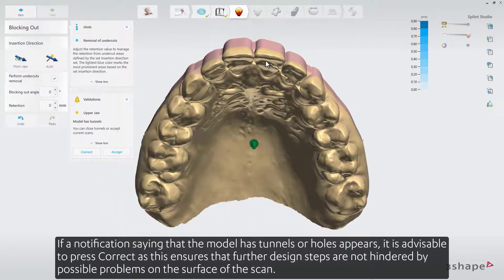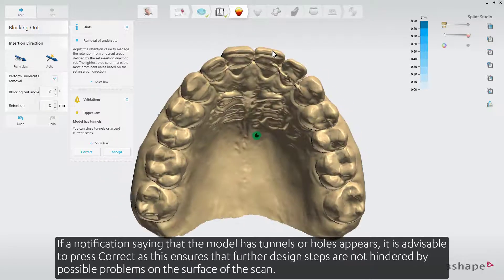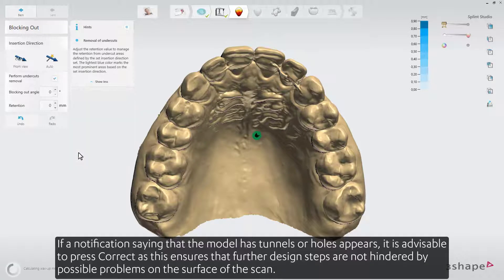If a notification saying that the model has tunnels or holes appears, it is advisable to press Correct, as this ensures that further design steps are not hindered by possible problems on the surface of the scan.